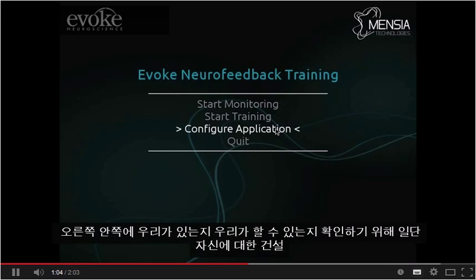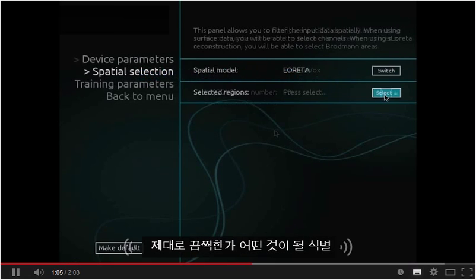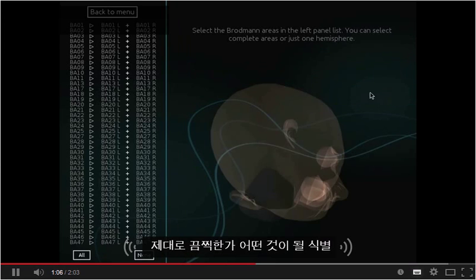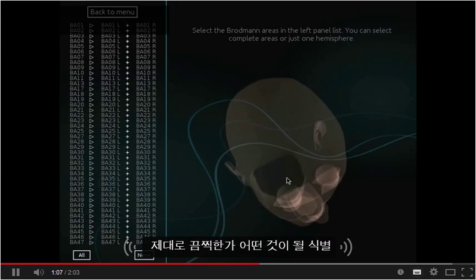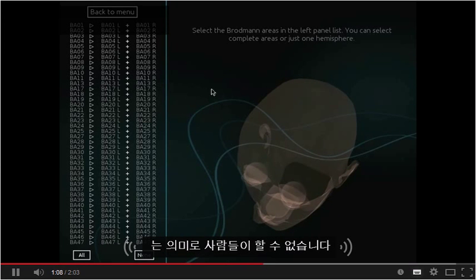Once we have made sure that we can correctly identify the cerebral activity, it is now possible to have a deeper look into the application design.